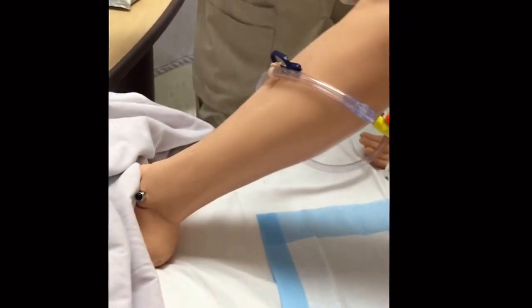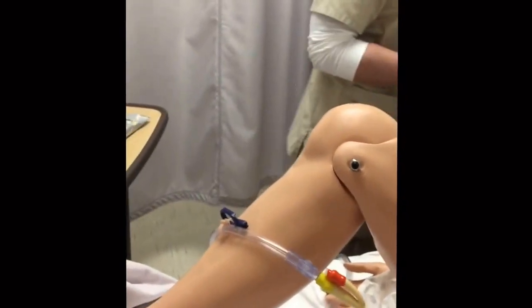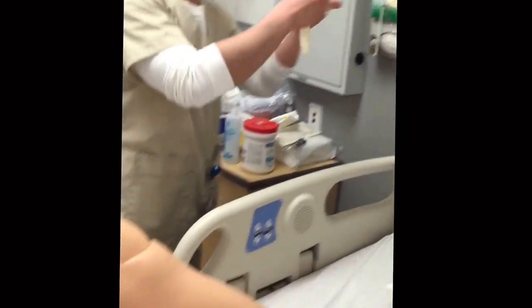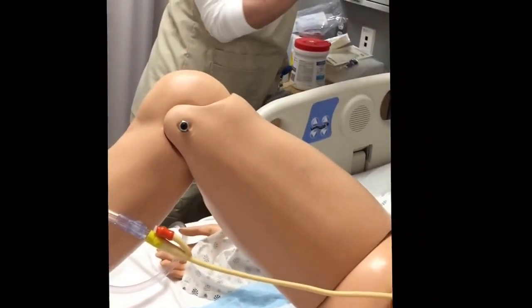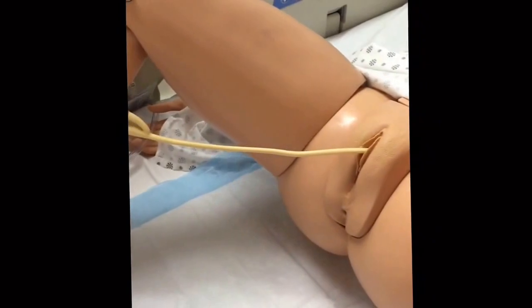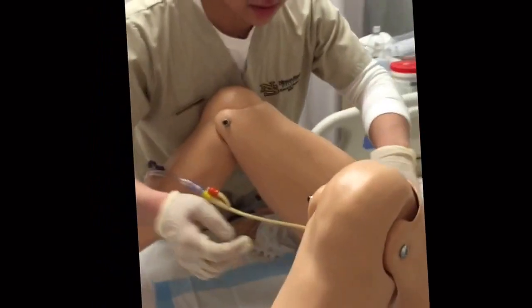So now that this is out, make sure you clean. I'm just gonna put clean gloves on again, just so I don't give her any infection or anything. Alright, so I'm gonna pull this out, and please let me know if you feel any pain, okay? So please just slowly inhale and exhale for me. Just relax. Try to relax as much as you can, okay? So I'm gonna pull it now.